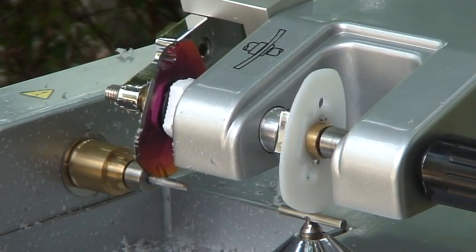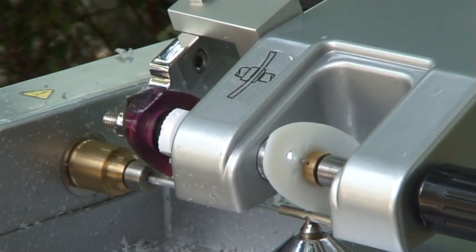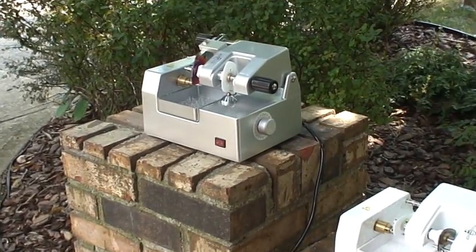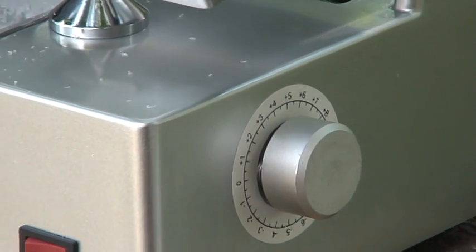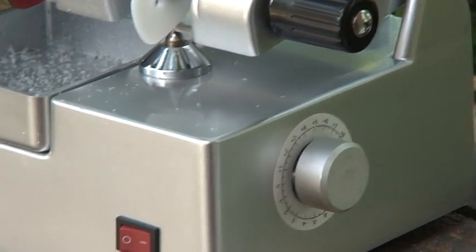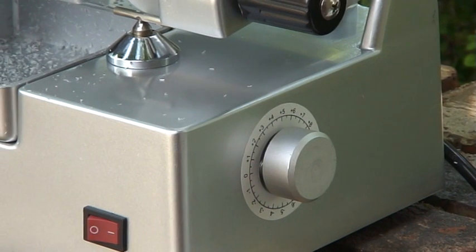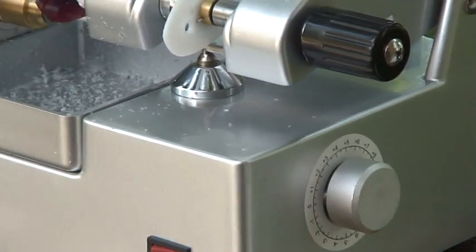Now, if you made your cut and you discovered that you've made the lens too big, which would be a fortunate thing, there's an adjustment here on the side, and I've got this all the way as wide open or as big as it'll go. You can rotate that knob counterclockwise and it decreases the size of the target lens, or increases it as you go positive. So I've got this first cut set as large as I can get it, because just like a haircut, you can always go shorter, but you can't put it back on.